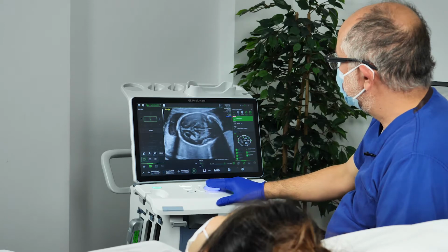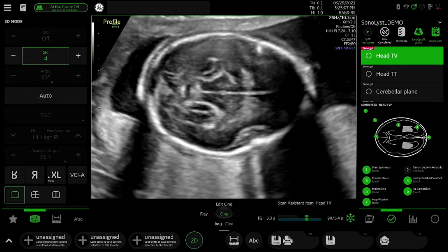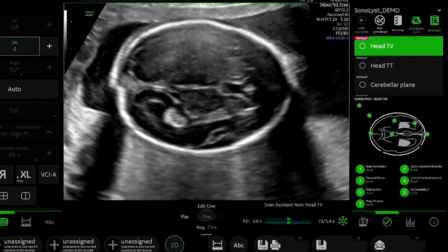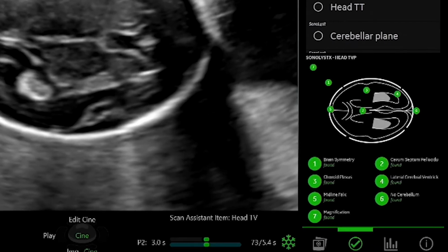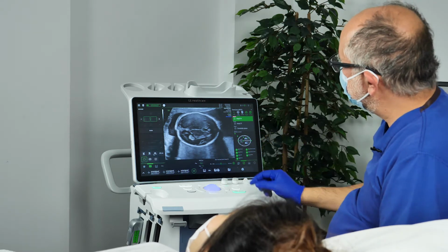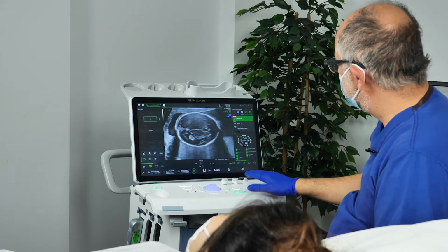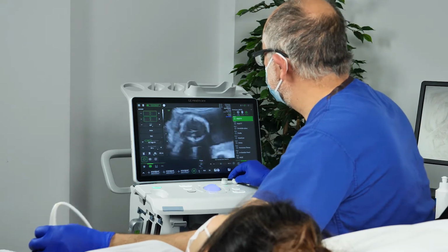I'm going to spool back now. I'm just going to spool back to get to a place there. You see, I've gone back and it's reanalyzed the picture now. And it's saying, yep, now you can see that little structure, that cavum septum pellucidum, which is a really important structure to see during the examination. So there's a real time element as well to it. Not only is it recognizing the image, it's looking for all those little structures. But if it hasn't seen one, you can go through your little cine loop and discover the right image in there.